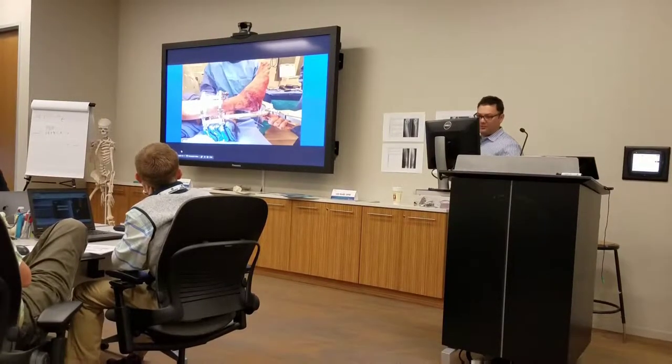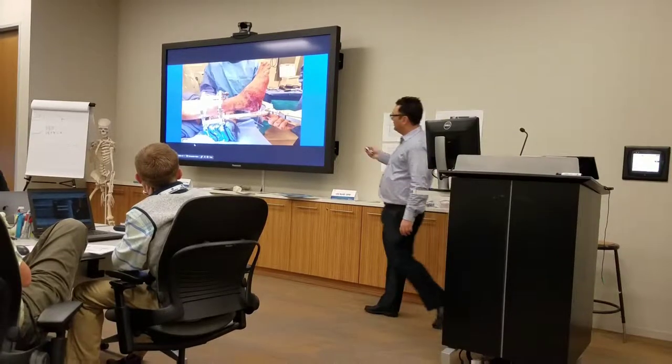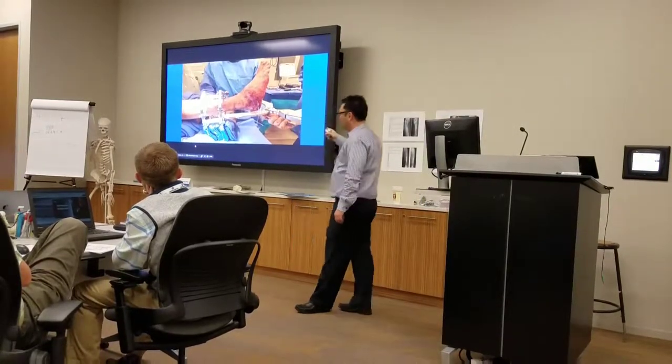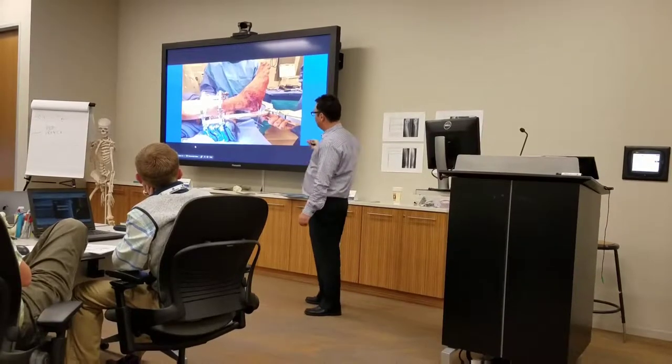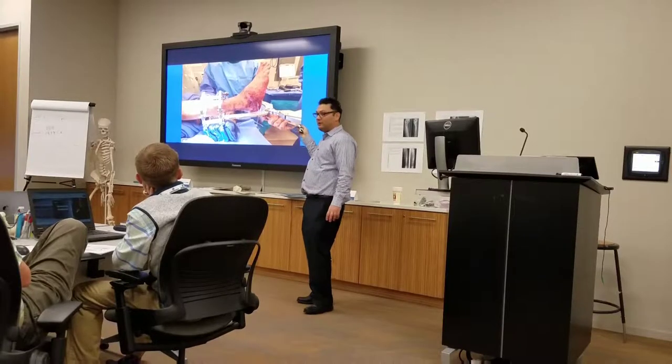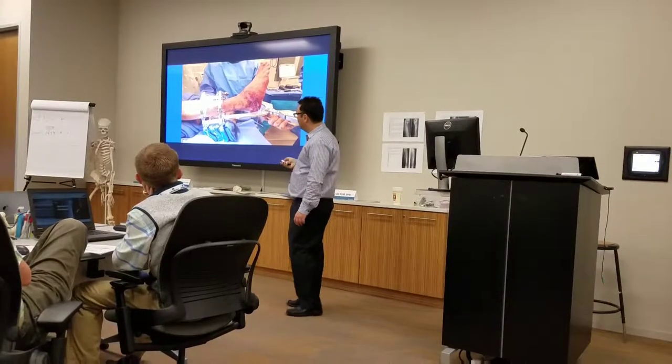Here is the miter frame on with the Gigli saw hanging out. I don't wrap up my Gigli saw. You saw yesterday, I just kind of let it hang. Nothing really happens to me. But you can see that obviously we were trained in the same place, with similar techniques over there.